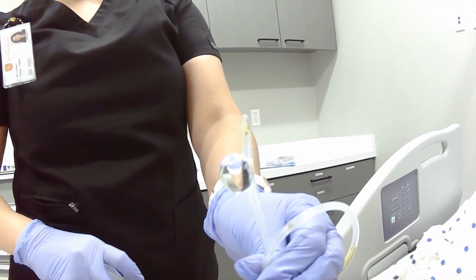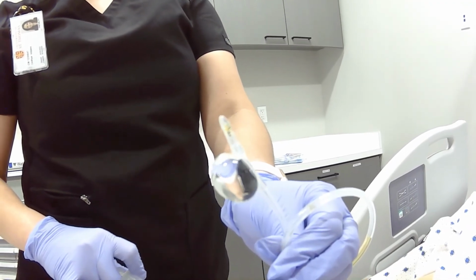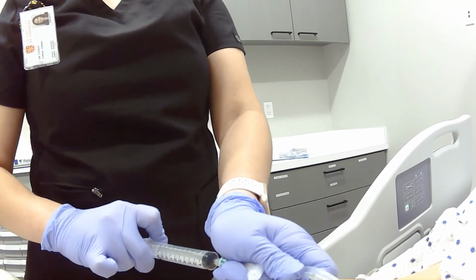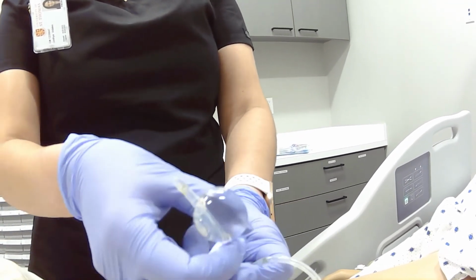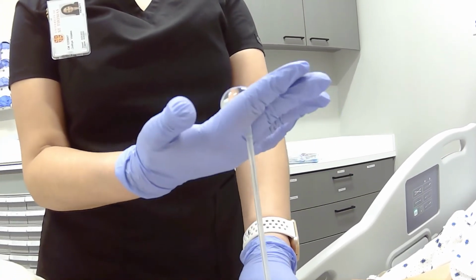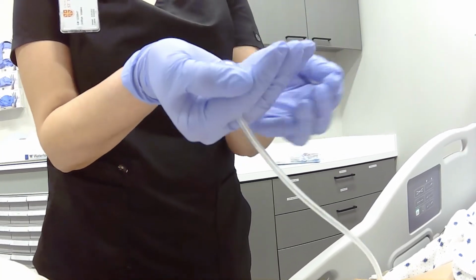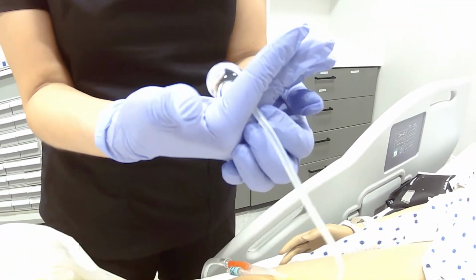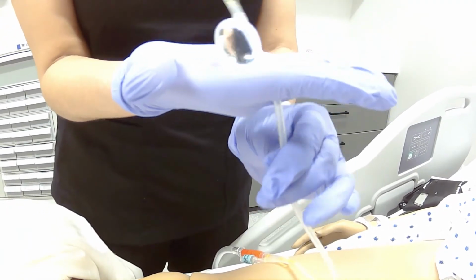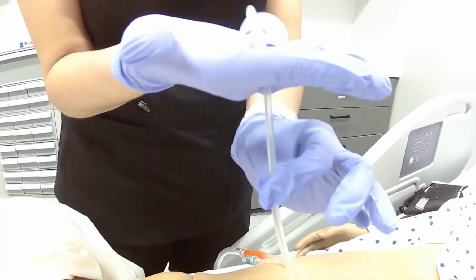This balloon will sit in the bladder and prevent the catheter from coming out generally. So this is the bladder, my hand is the bladder, and the catheter tip is down the urethra. You can see when we're tugging on it, it's secured.